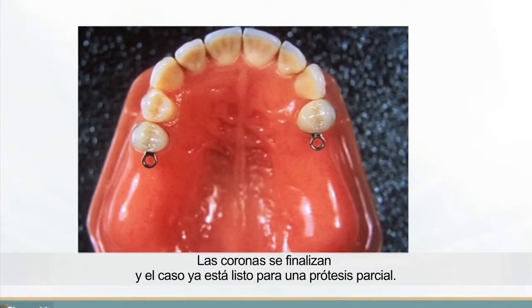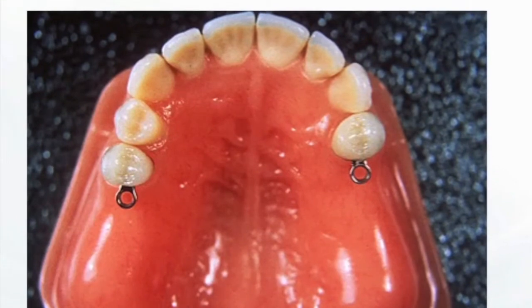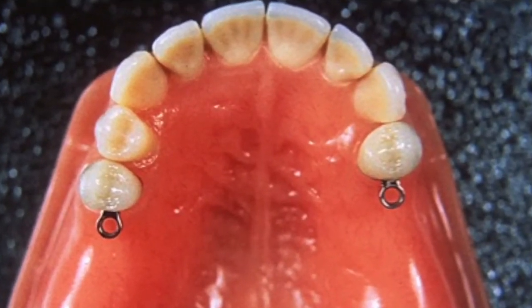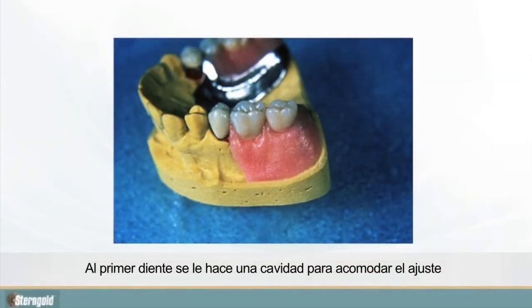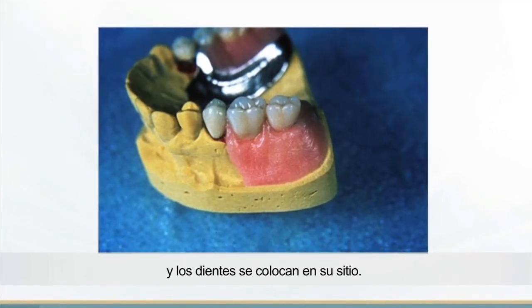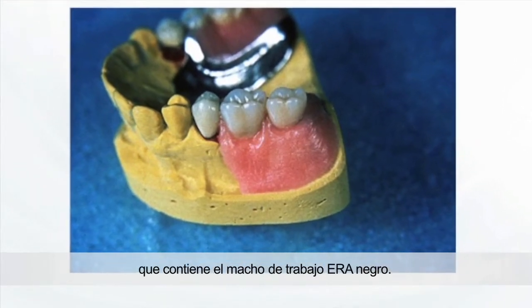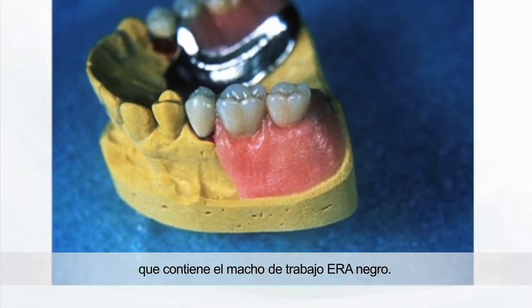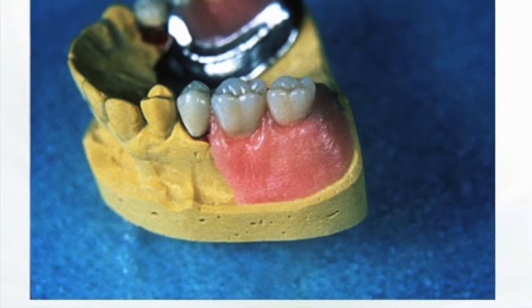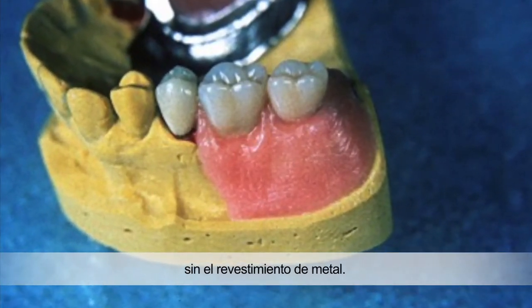The crowns are finished and the case is ready for the partial frame. The first denture tooth is hollowed out to accommodate the attachment and the teeth are set in place. Most people select the metal jacket which contains the black ERA processing male. Otherwise, the black processing male without the metal housing must be used.